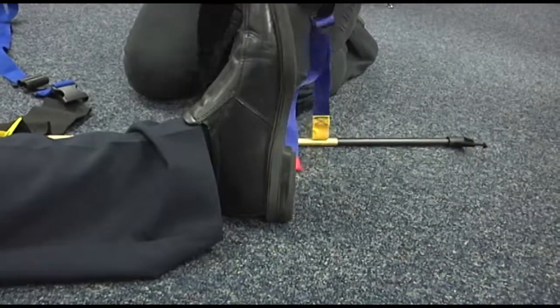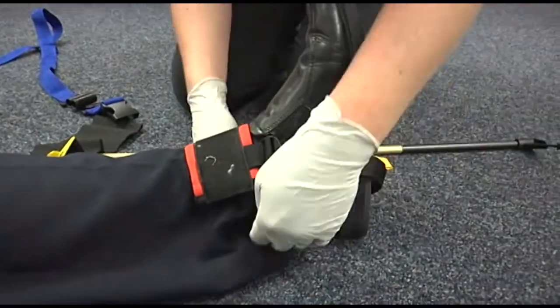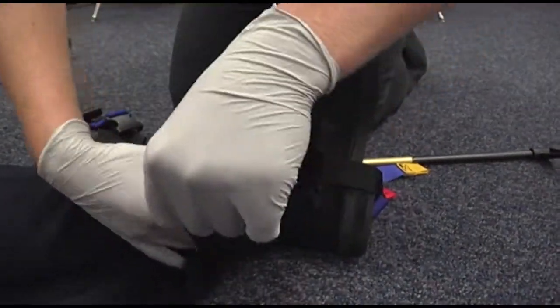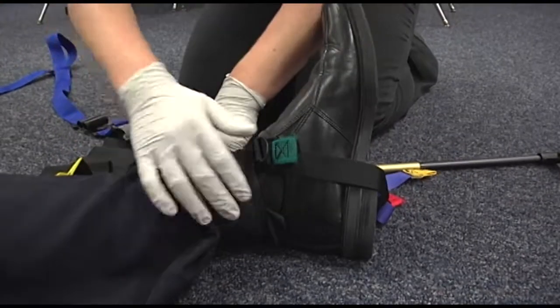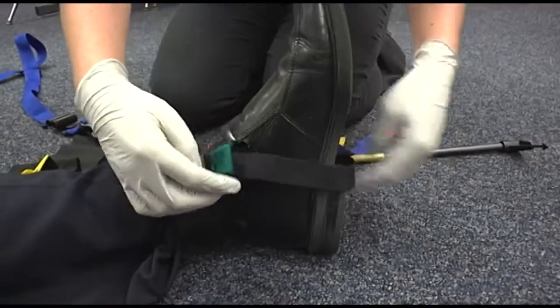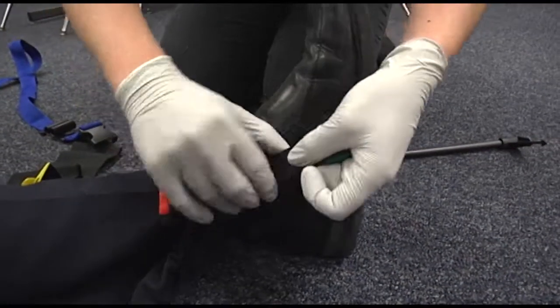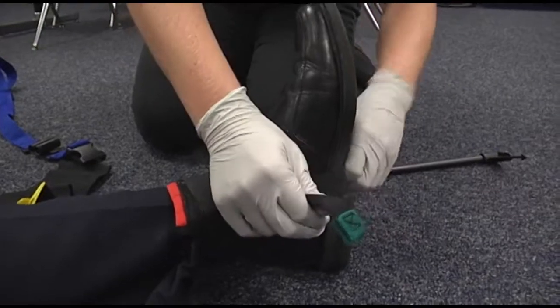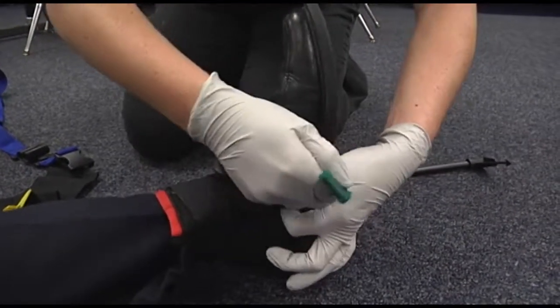You can apply it like that — just put it over the foot. It can be put on the back. You're going to tighten down the ankle hitch by pulling on the green tab, making sure that the bottom is still underneath the foot.